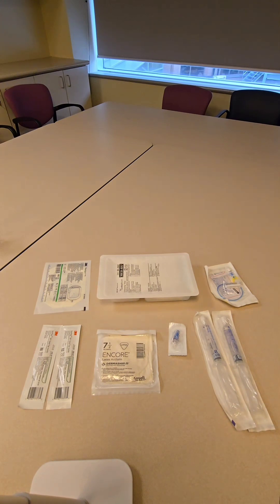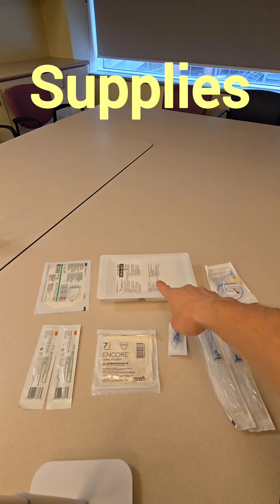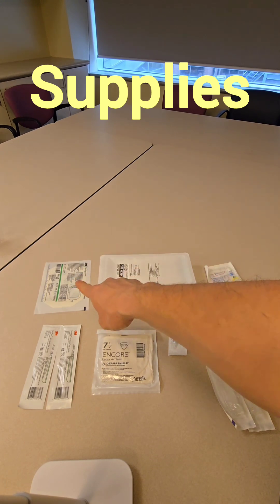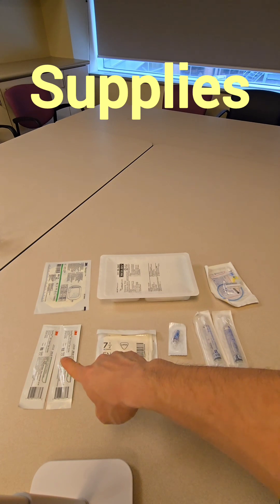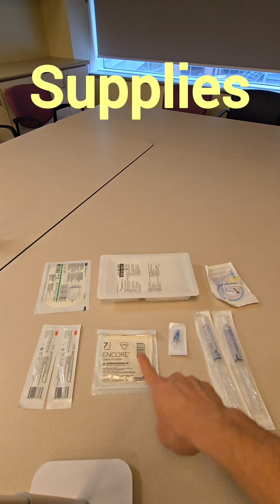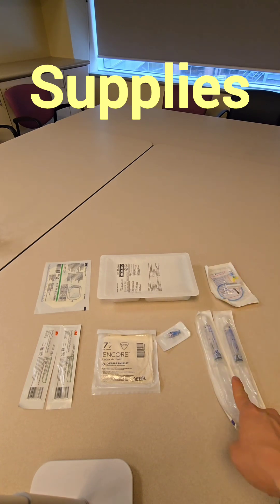Next we're going to gather our supplies. We have our portacath needle, our dressing tray so we can set up a sterile field, the dressing to cover our portacath, chlorhexidine sticks as an antiseptic cleaning solution, our sterile gloves, our needleless connector to attach to our needle, and saline flushes.